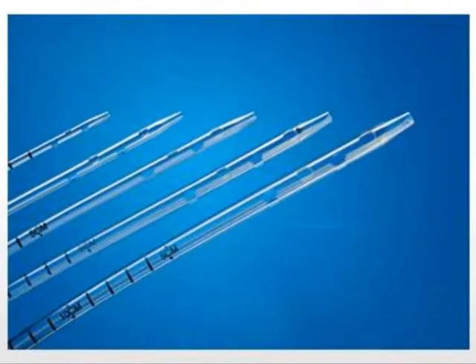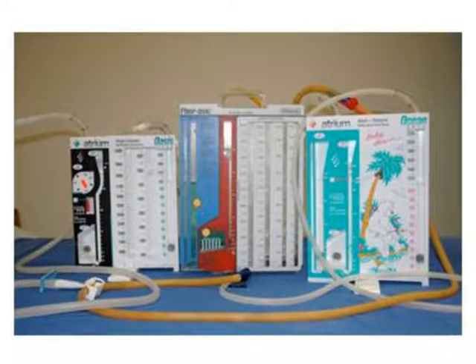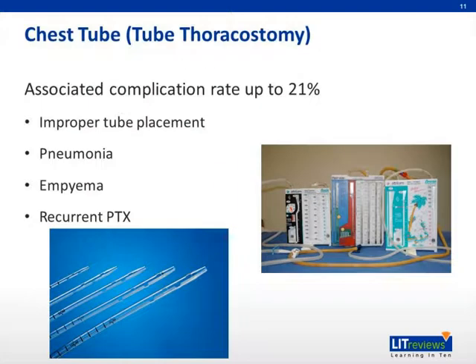On the bottom left-hand side, we see a picture of the distal portion of a chest tube, and on the right side, we see the Pleurevac, which is the device that the chest tubes are connected to that collects air and can provide suction as well as an air-water barrier.